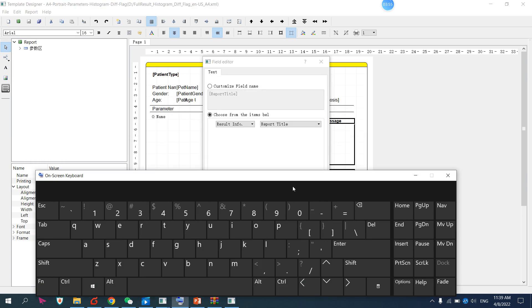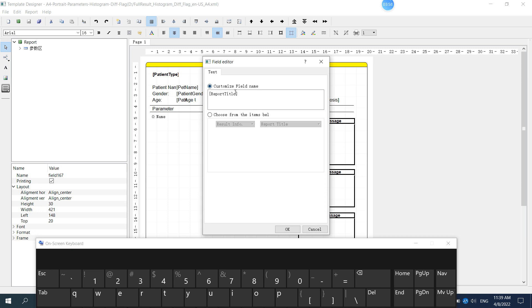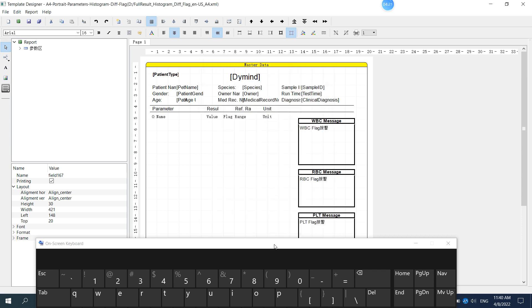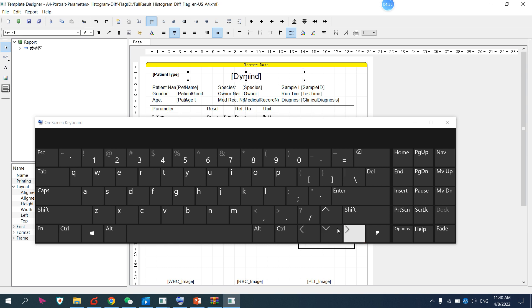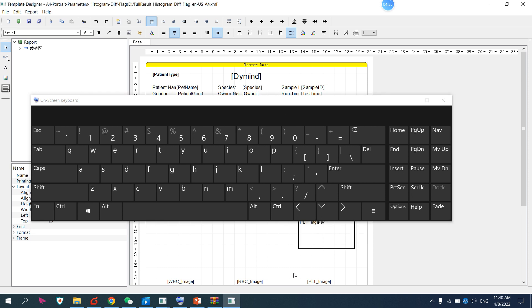Just double-click on it and you can customize it. For example, I want to customize the title — I want to change it. You can adjust it: move it up, move it down, move it left or right according to your requirement. All elements work the same way.